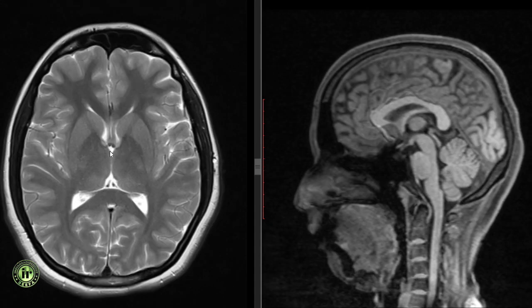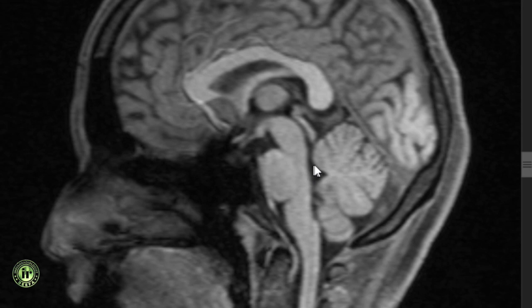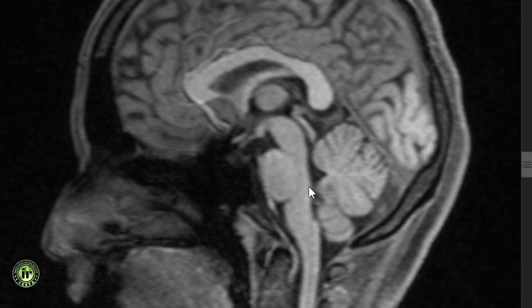The third ventricle is a narrow midline structure with the diencephalon as its boundaries. The fourth ventricle appears triangular in sagittal section, with an anterior floor, a roof and two sides converging to a posteriorly directed apex. The floor of the fourth ventricle, or the rhomboid fossa, is formed by the posterior surface of the pons and the upper medulla. The upper part of the roof is formed by the superior cerebellar peduncle and superior medullary velum, and the lower part by the inferior medullary velum, which has a midline aperture called the foramen of Magendie. The CSF is formed by the choroid plexuses.